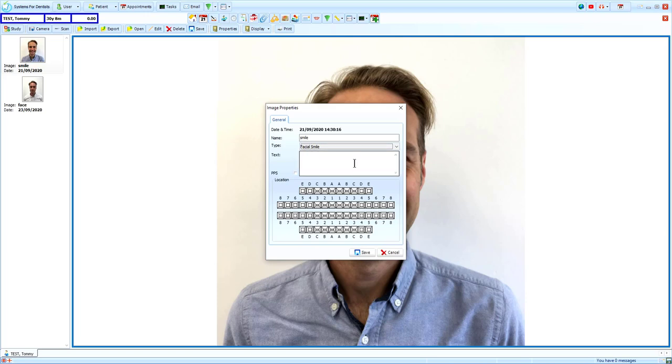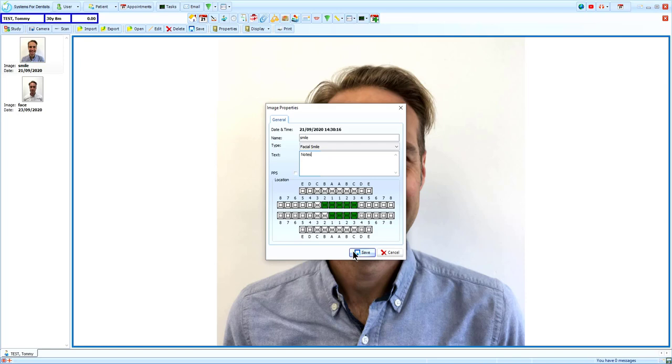It is then possible to add notes to the image, and with location assign the image to the teeth in the patient's chart. This makes the image visible directly from the patient's treatment screen. To confirm these changes, click Save.